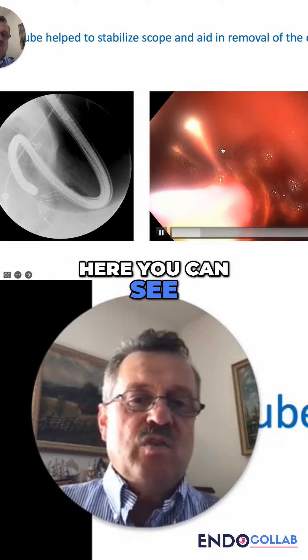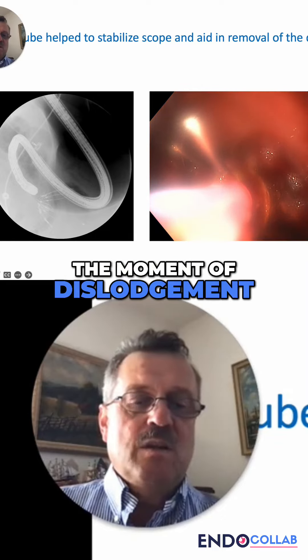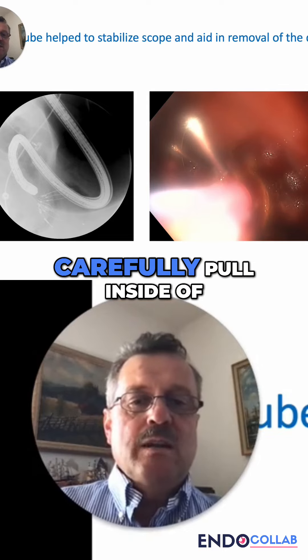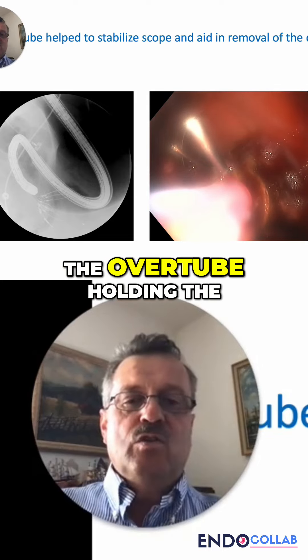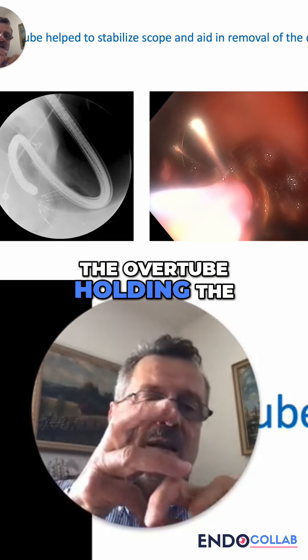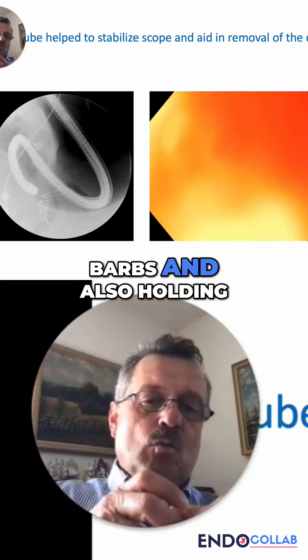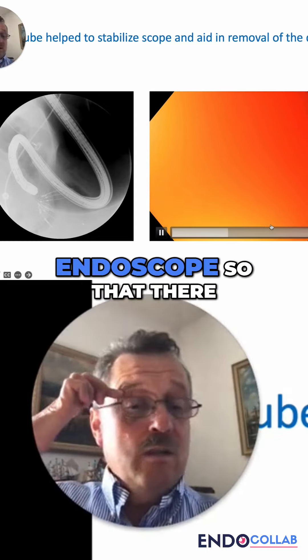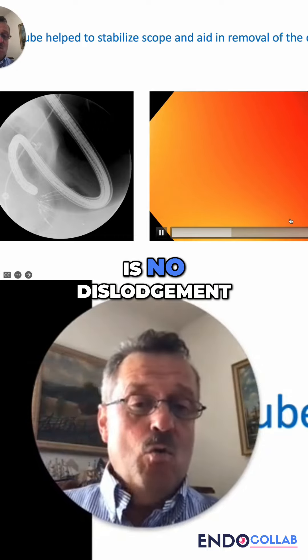Here you can see the moment of dislodgement of most of the metal barbs, which we carefully pull inside of the overtube — holding the barbs and also holding the device with your left hand on the endoscope so that there is no dislodgement.